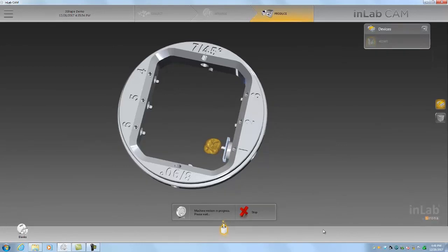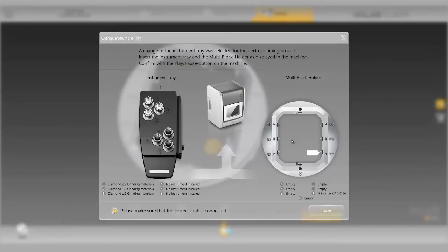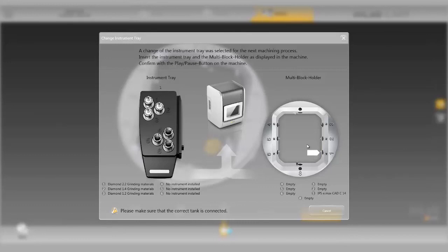This is communicating with the machine now and starting the calculation. This is indicating what tools we have set up and which position the unit is going to be milled out of. And now we just have to click the play button on the mill.